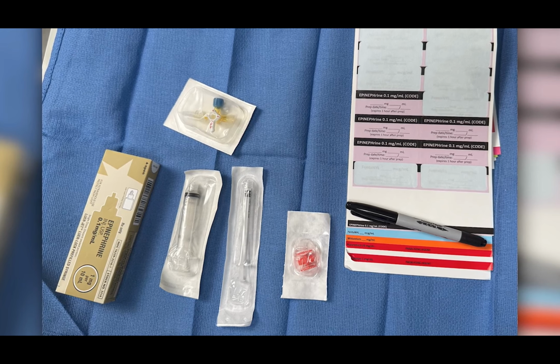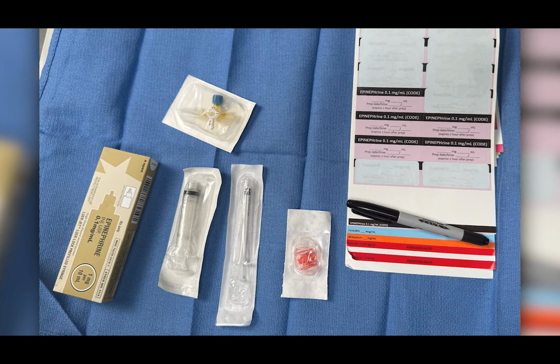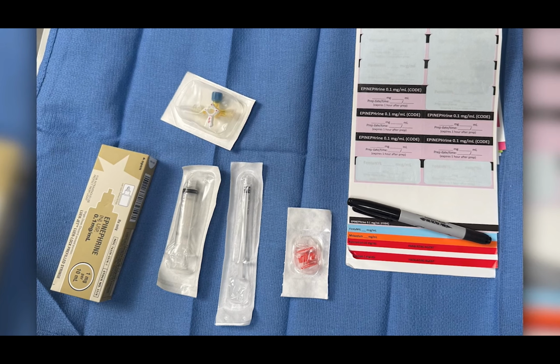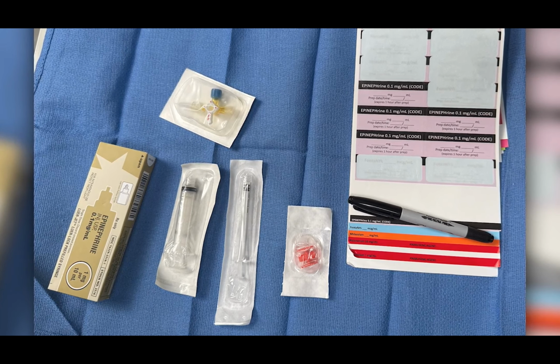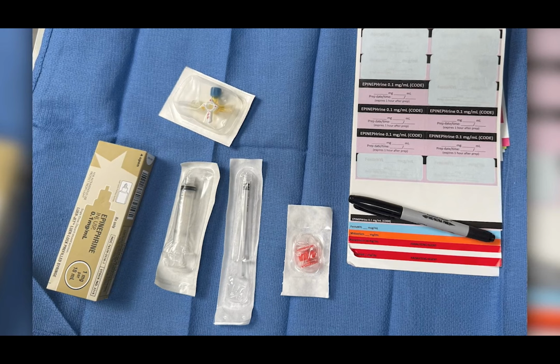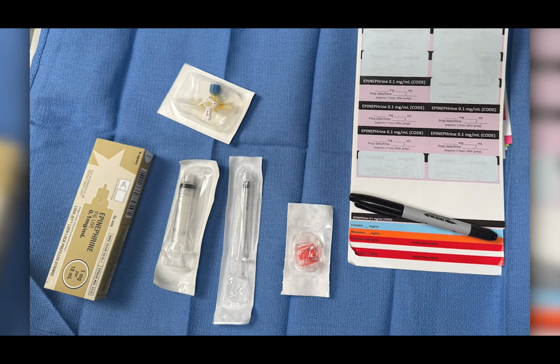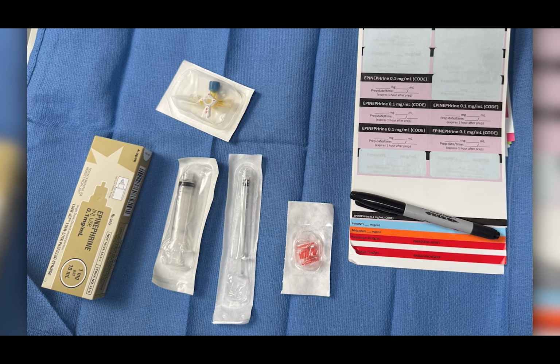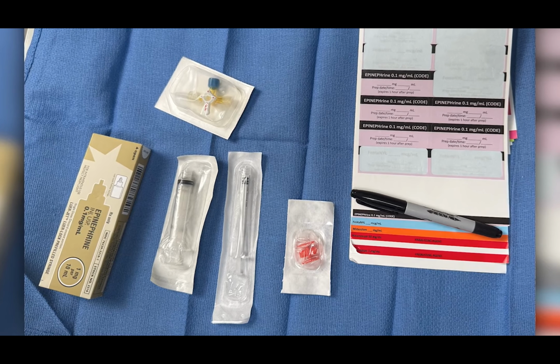You will use a 3 or 5 ml syringe for intratracheal administration. These two different sizes of syringe serve as a visual reminder that epinephrine has two routes and two different doses. The 1 ml syringe is used for the smaller IV dose, and the bigger syringe is for the larger intratracheal dose. You'll also need a 3-way stopcock or a medication dispensing connector, medication labels, and something to write with.